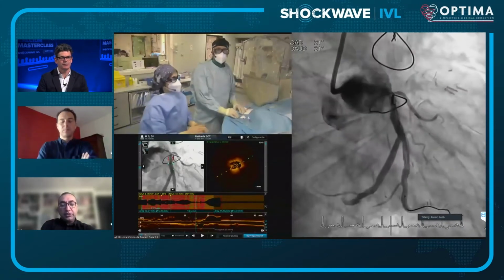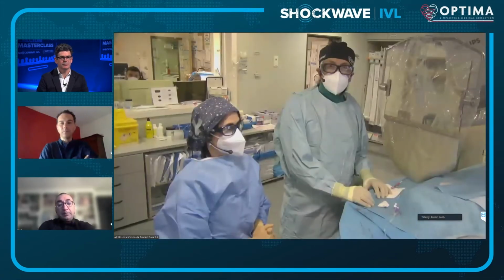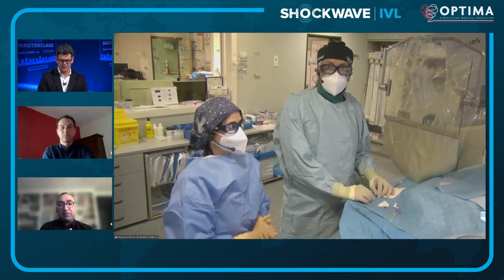Yeah, that's a great question and a great case again from Javier and the team. I guess before lithotripsy, but even right now in the United States, we've just gotten lithotripsy approved by the FDA this year. So we've just started using it in the last few months outside the context of a clinical study. And it's only in limited centers still available. So I think for the US, this is still current practice: what would you do without lithotripsy? And I think in most centers, they'd be going with atherectomy, probably going with a 1.5 or 1.75 burr, and then followed by cutting balloons.